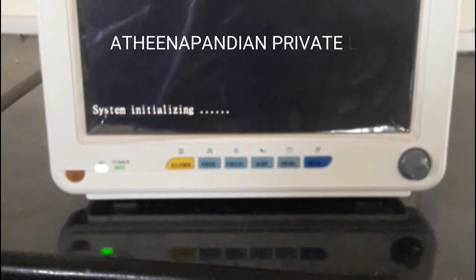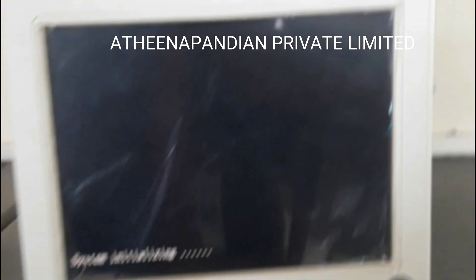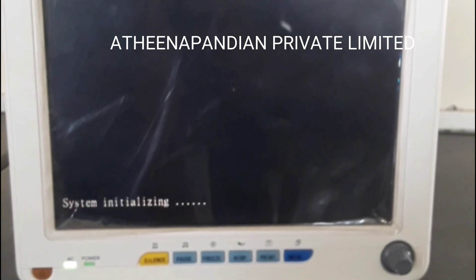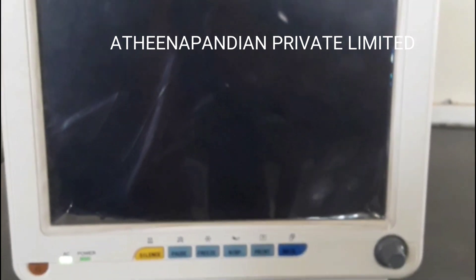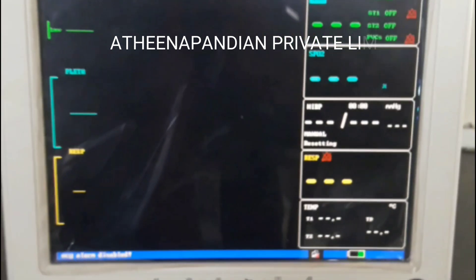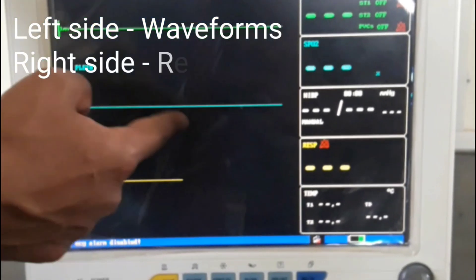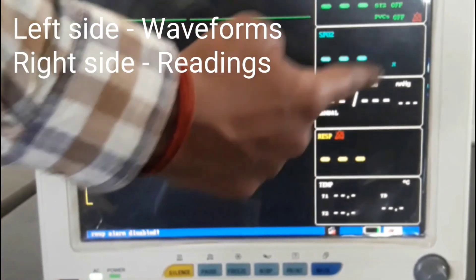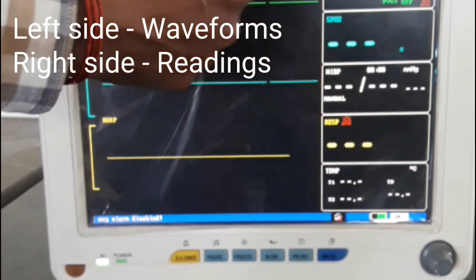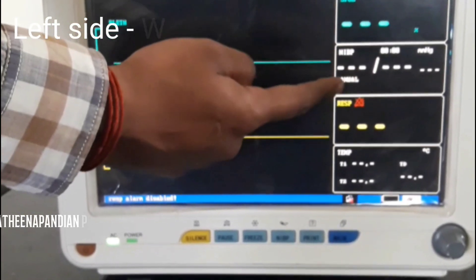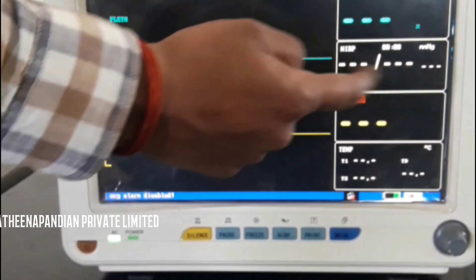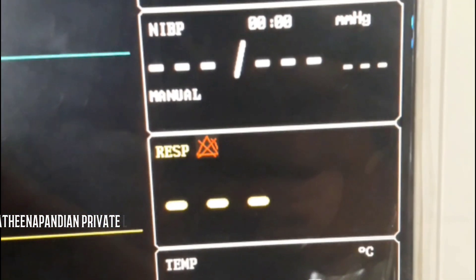Once powered on, you can see two different views on the monitor. The left side displays waveforms of all vital parameters — the ECG waveform, SpO2 waveform, and blood pressure waveform. The right side displays numerical values — temperature, blood pressure, and pulse rate. All numerical values are shown on the right side and all waveforms on the left side.